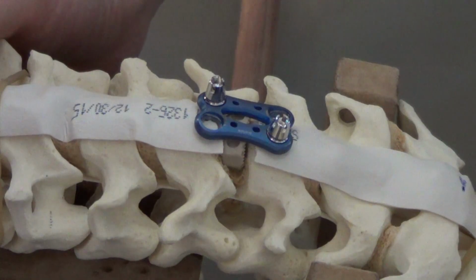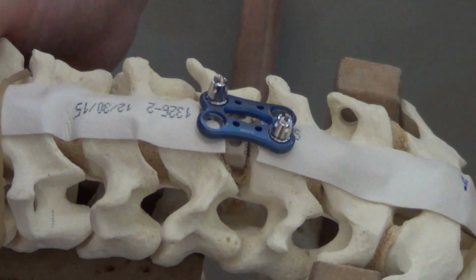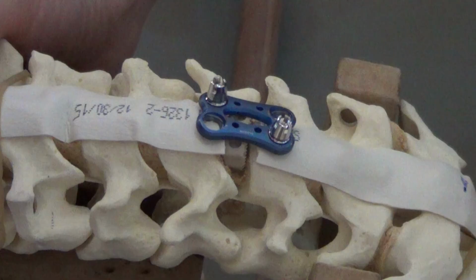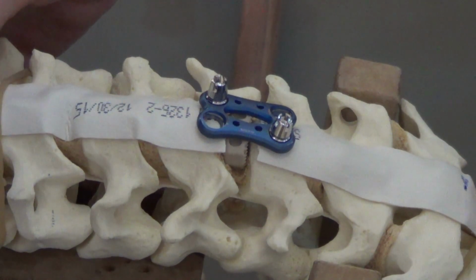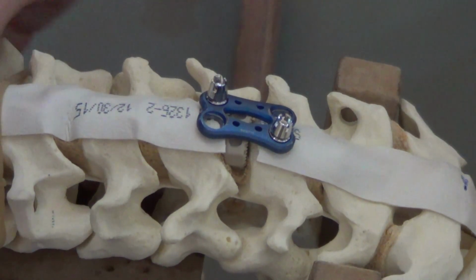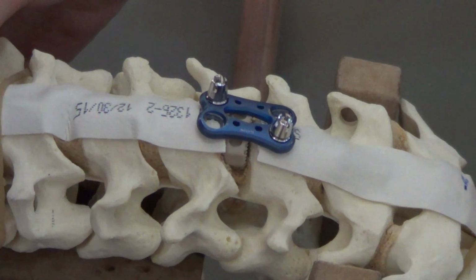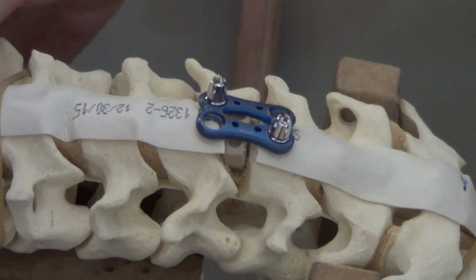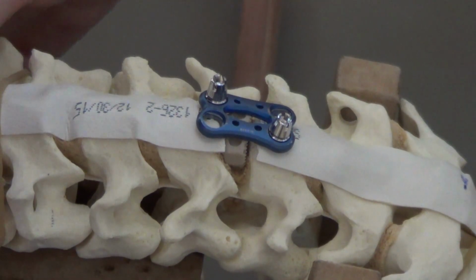Usually the size of the screw comes either 14, 16 or 18 millimeters. And now in your pre-operative MRI or CT scan, you can find out how much it is. These are usually, nowadays we have these screws which are all locking screws. So if it is locking screw, it is not necessary for the screws to have a bicortical purchase. So unicortical purchase is good enough. So you find here, looking at the sizes, usually in a male Asian, we use about 16 millimeter screw.